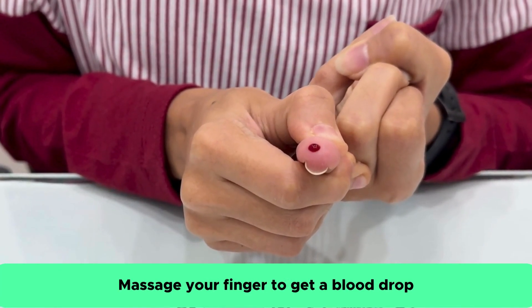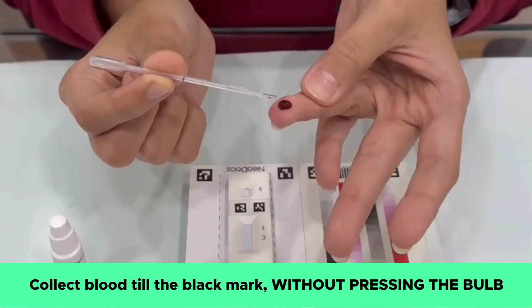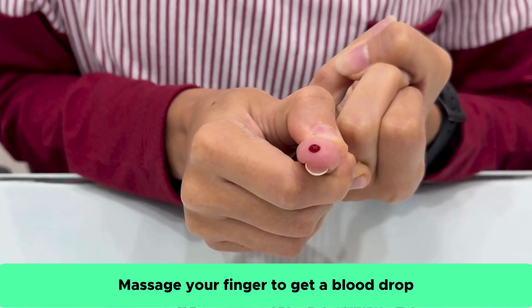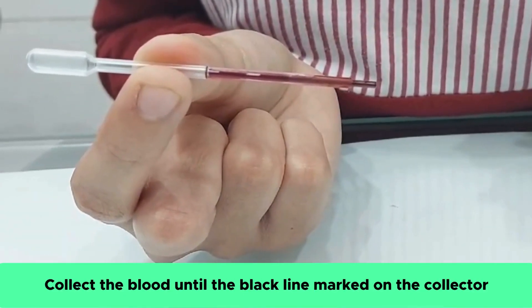Massage to create a blood drop. Now, use the blood collector without pressing the bulb and touch it to the blood drop. If the amount of blood collected was not enough, then please massage the finger again to collect more blood. Please collect blood until the black line marked on the collector.